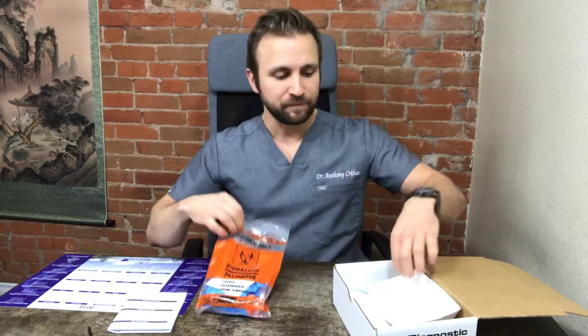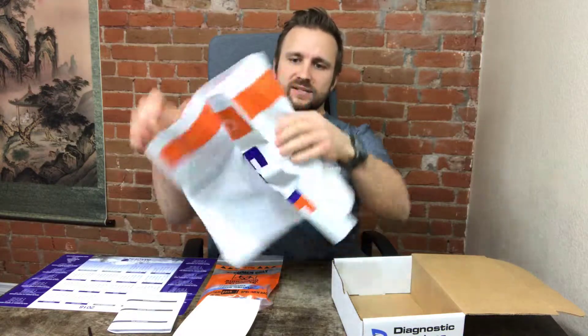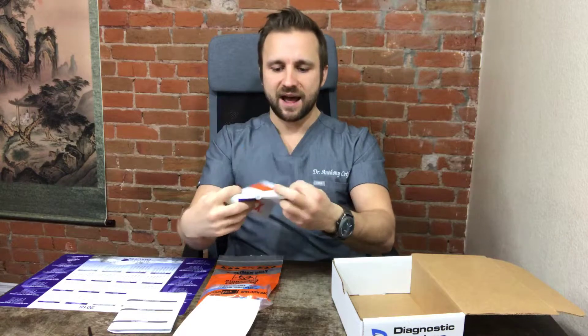We want to open the box and make sure we have all the contents inside. First thing you're going to find is a requisition form — you're going to fill out your name, date of birth, and information. Second thing is a biohazard bag with some stuff in it, which we'll go over in just a second. You're also going to find a hot dog tray-looking thing, and then you'll find a FedEx bag — just the bag, nothing else.